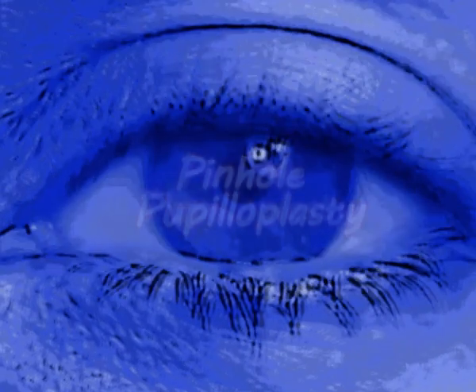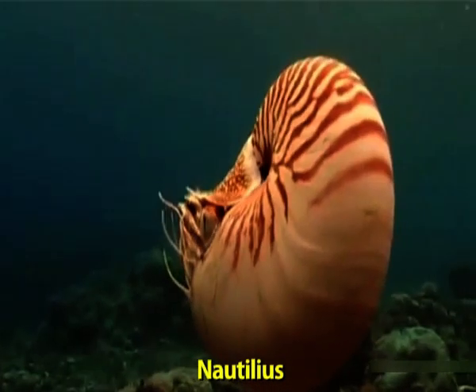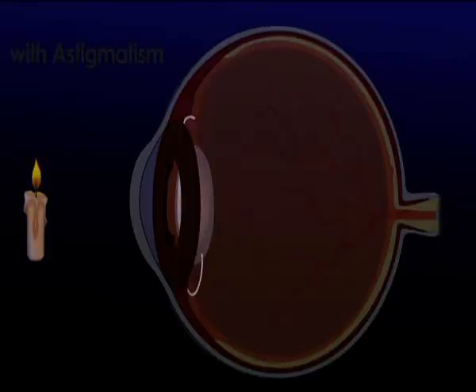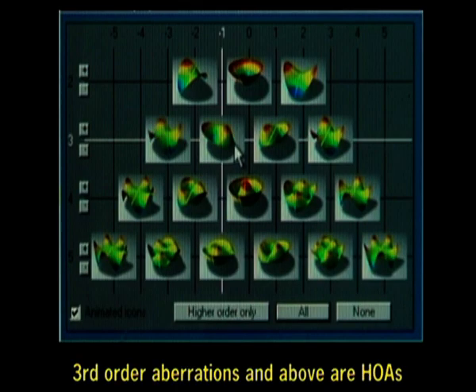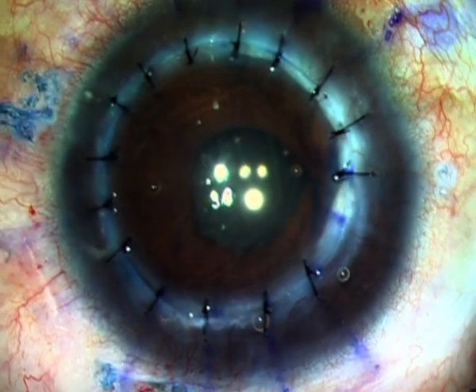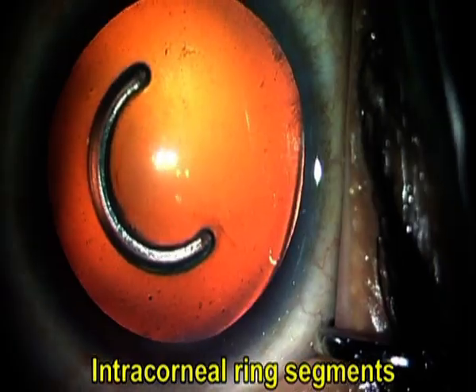Pinhole pupil, by definition, is a pupil contracted to the size of a pinhole. The nautilus is a marine mollusk and has developed an inborn pinhole eye. Significant irregular corneal astigmatism leads to ocular aberrations. High astigmatism can occur in radial keratotomy, penetrating keratoplasty, corneal injuries, intracorneal ring segments, or keratoconus.